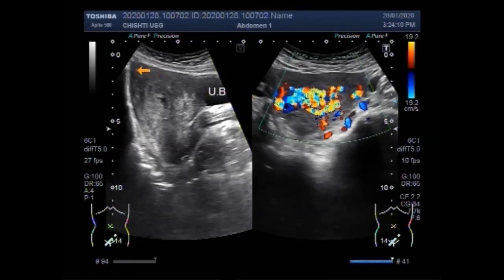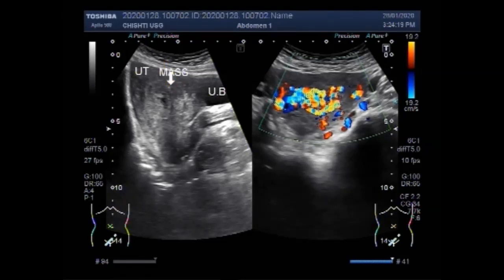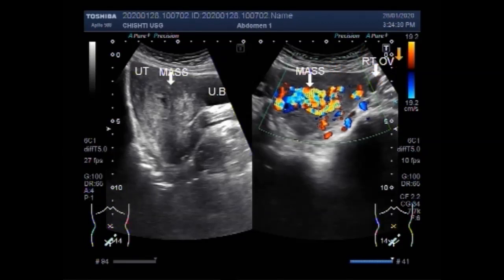This is the uterus and this one is the mass, having increased blood flow in its interior. You can also see the right ovary and the left ovary.